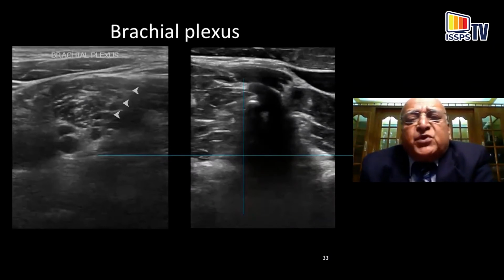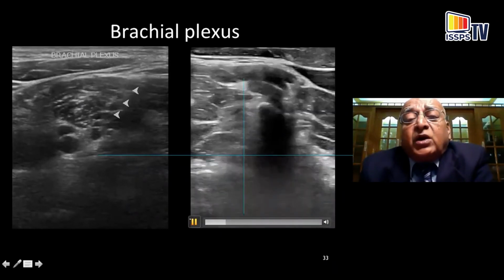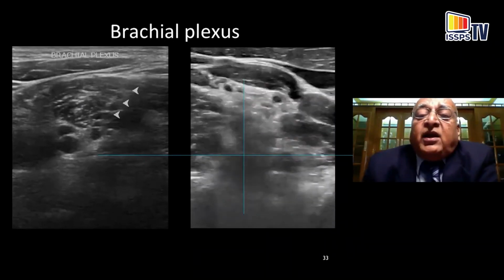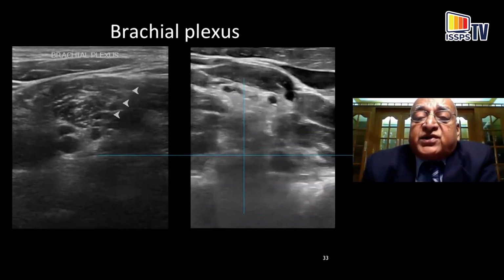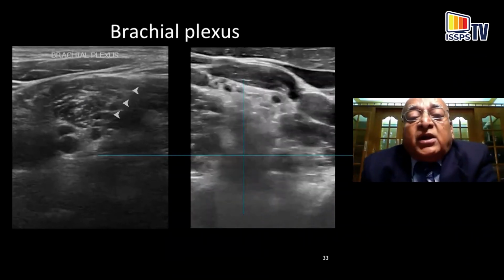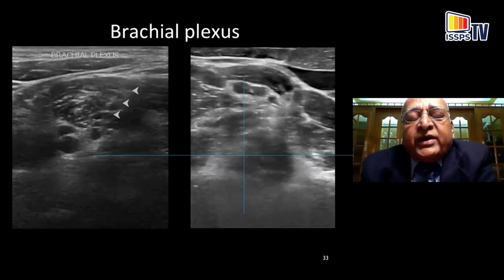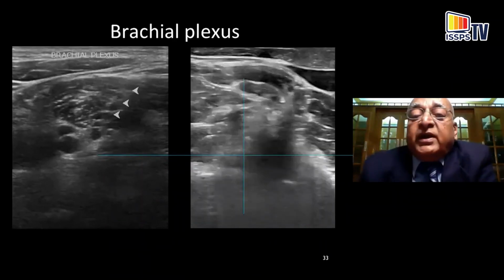This is something which most of you know, the brachial plexus. What I'm trying to do here is trace it for you from the foramina all the way back into the brachial plexus. Just for practice, but I want to stress the importance of identifying the structures based on their origin. So now you can be sure that the grapes that you see in your interscalene block do actually come from the nerve roots from the foramen.